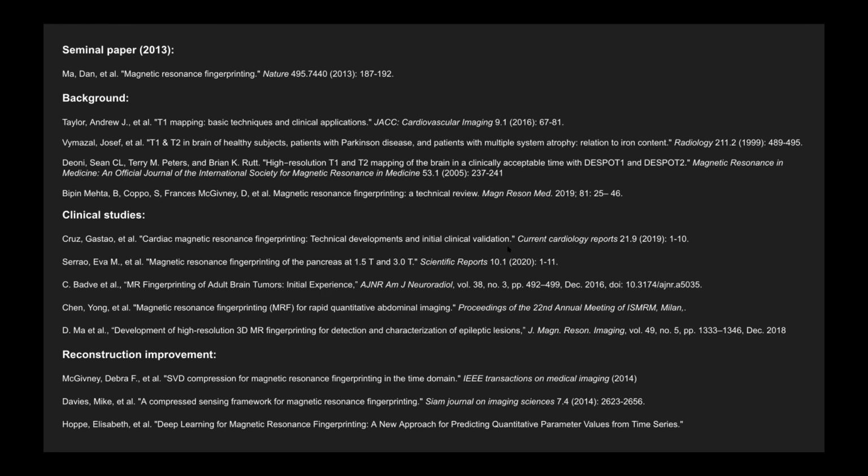And how exactly is it feasible to include that in your dictionary, to accurately come up with that model? Is that possible? Yeah, so as we saw, B0 inhomogeneity causes off resonance, where you don't expect it. And B1 inhomogeneity causes errors in the flip angle. Got it. Yeah.